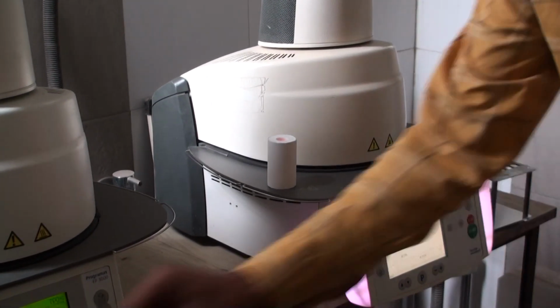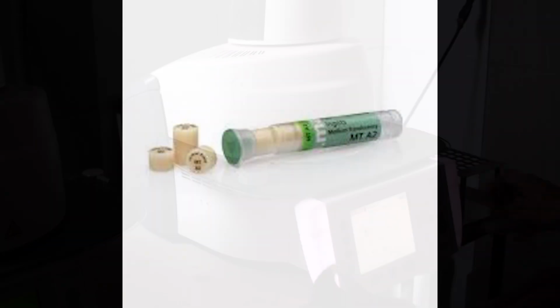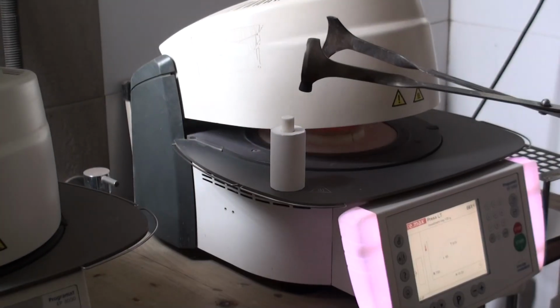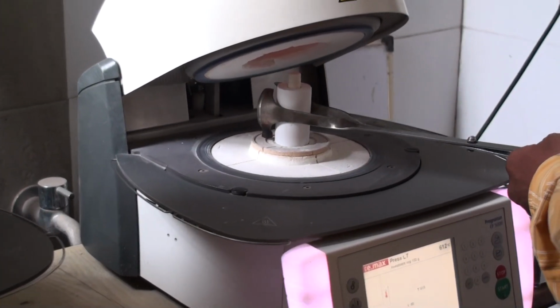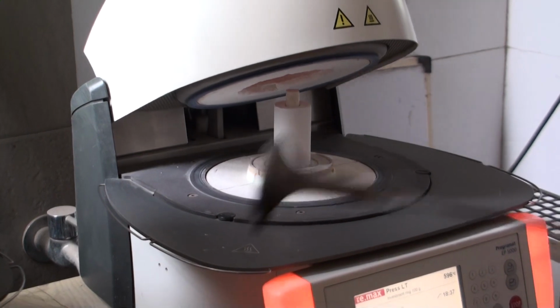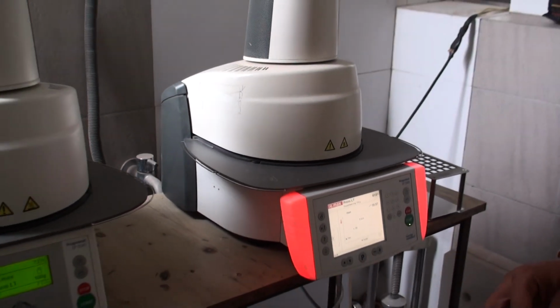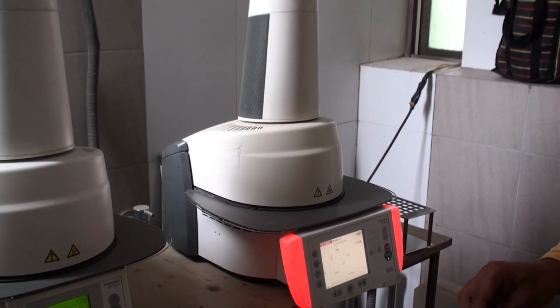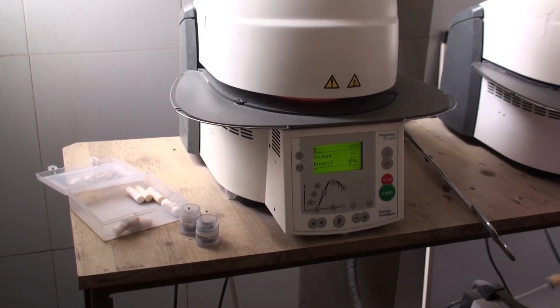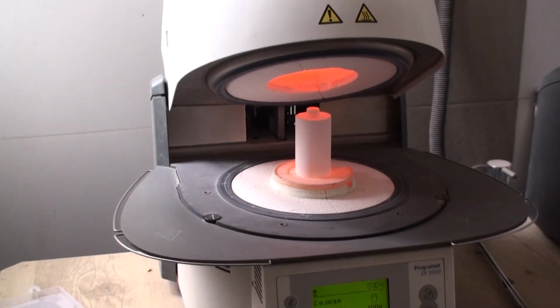this is our Emax press system. So we put an ingot of Emax in there and put a plunger in there, and take the hot ring, put it into the preheated furnace, and that furnace basically is a vacuum furnace, so it takes away all the air from it, and the ingot that got placed before the plunger actually pushes that ingot when it melts at a certain temperature.